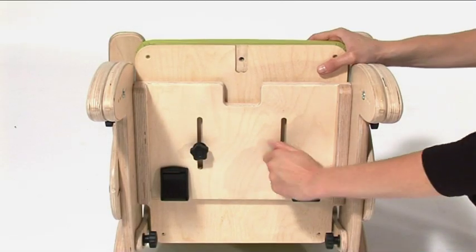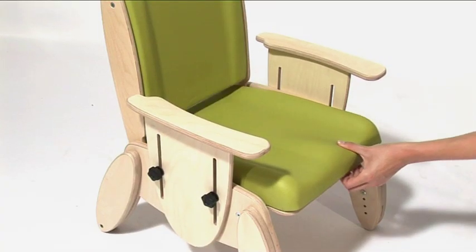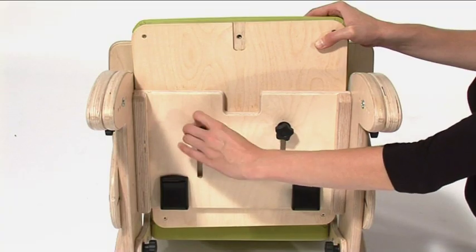To adjust the seat depth, loosen the hand wheels. Slide the seat forward or backwards to the desired position. Tighten the hand wheels.